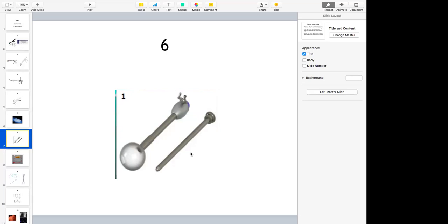Okay. Now regarding autoclave, since we have discussed autoclaving once, let us go over some important points right away. What is the principle of autoclaving? These are very common questions. The principle of moist autoclaving? Moist heat under pressure.